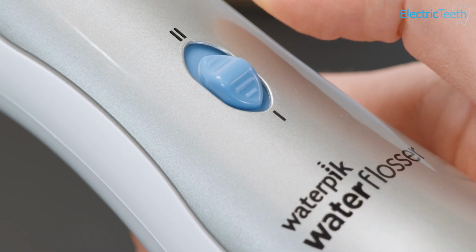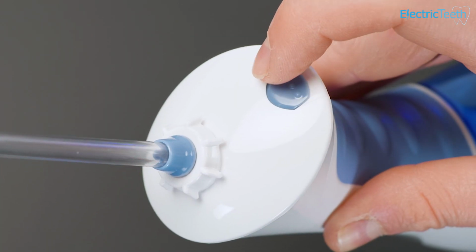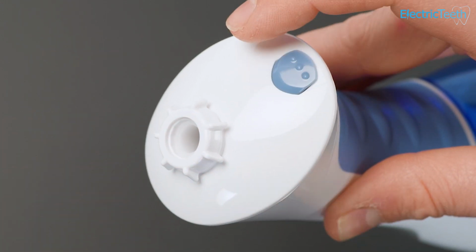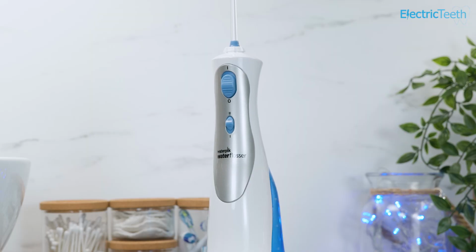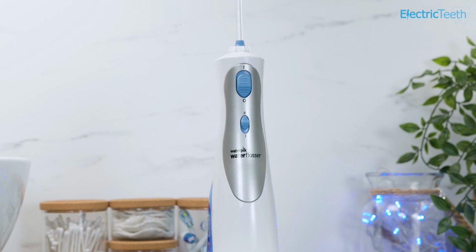It feels a little bit cheap in places. The slider buttons here on the front, they're a little bit spongy. They don't give the same firm response as you may expect from a slider. And then up here on the very top of the unit, you've got the eject or release button for the nozzle. It's just a bit rough around the edges. It can catch your fingertip a little bit. It's not super sharp, but it's just not as well finished as some of the other models that Waterpik themselves offer.